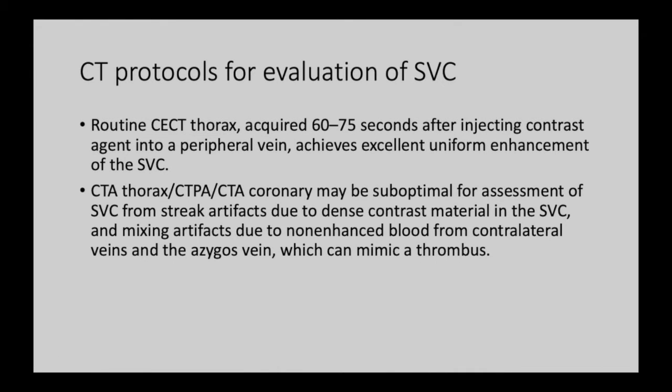CT protocol to evaluate the superior vena cava can be obtained with routine contrast-enhanced CT thorax, which is acquired at about 60 to 75 seconds after injecting contrast agent into a peripheral vein. And this is able to achieve excellent uniform enhancement of the superior vena cava.